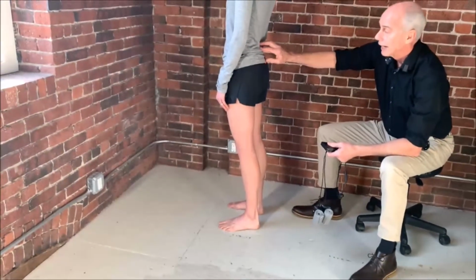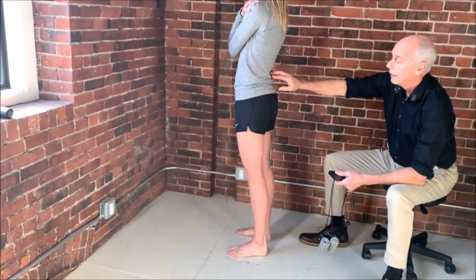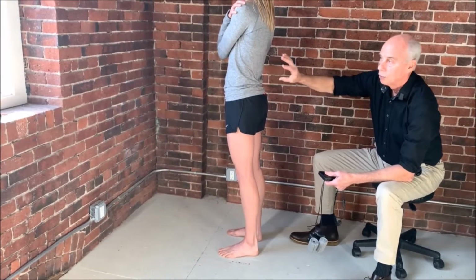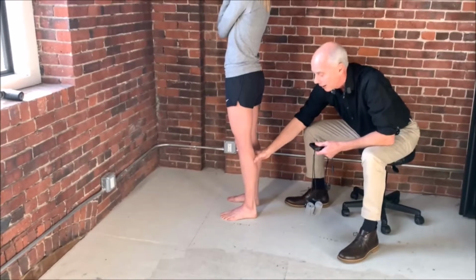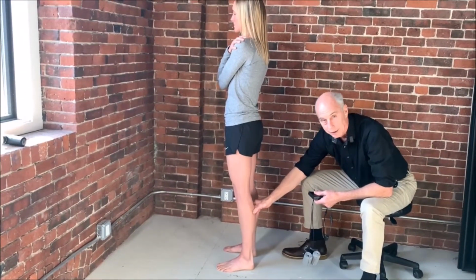And when you're standing, let me have you cross your arms in front of you and close your eyes. As Kim's eyes are closed, muscles in through here, the spindles are saying, hey, we're moving back and forth in this plane, so this is where we should be. Muscles down here, especially your soleus, are saying, hey, we're going backward and forward, and we want you to be balanced, so come back to this spot.